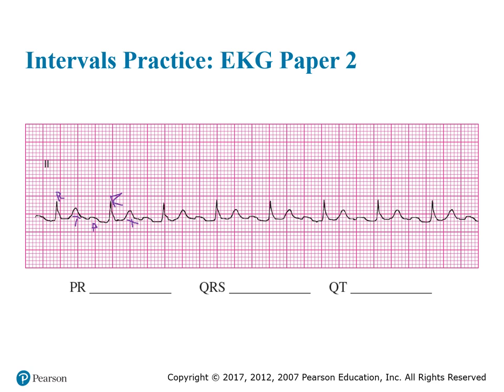So first thing we're going to do is calculate our PR interval. So it'll start here. And I will promise to try to draw this straight. Here to here. Oop. It's a promise. So to here. All right, so this is our PR interval. So if we count the little blocks, we have 1, 2, 3, 4, 5, 6.